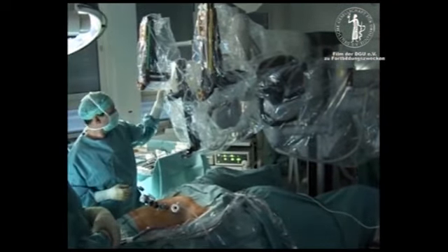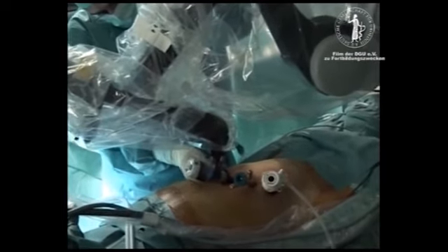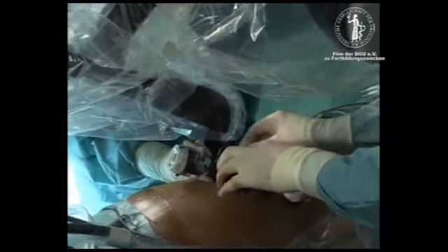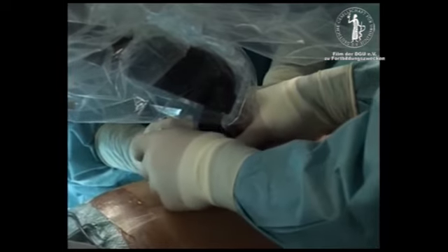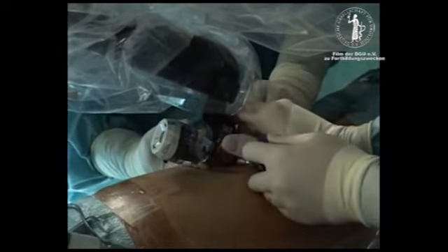The camera arm is lowered with the correct angle onto the camera trocar and is then fixed by the assistant. The camera is inserted into the arm and an abdominal inspection is performed.